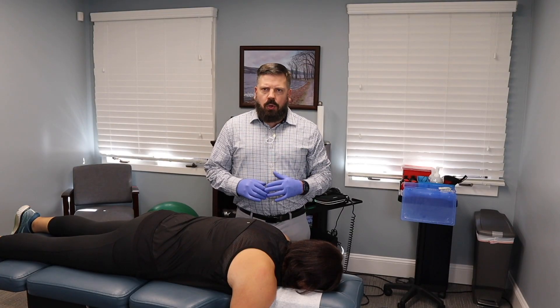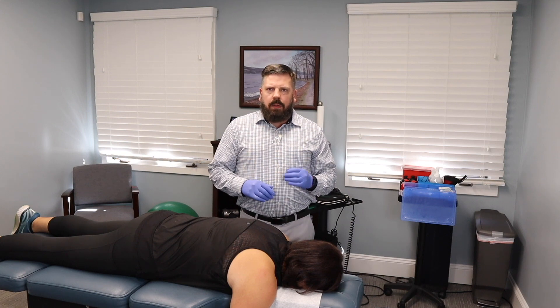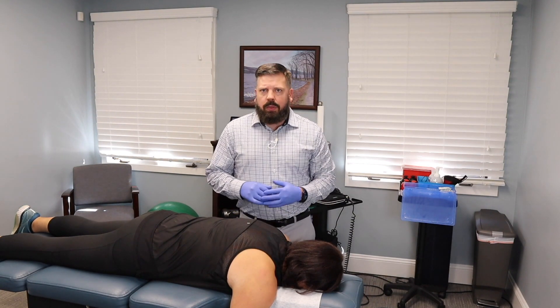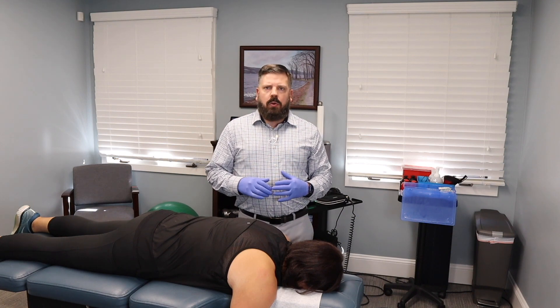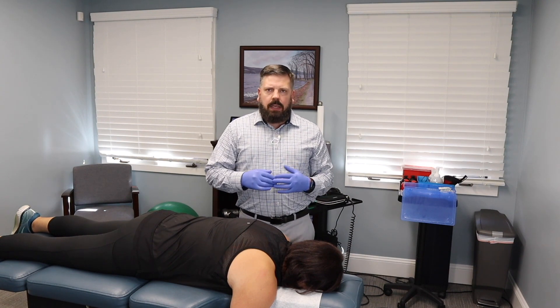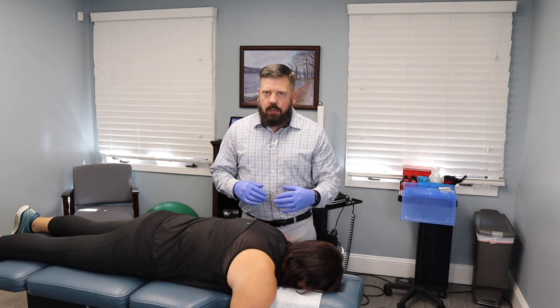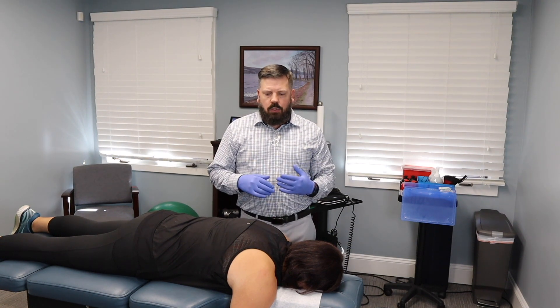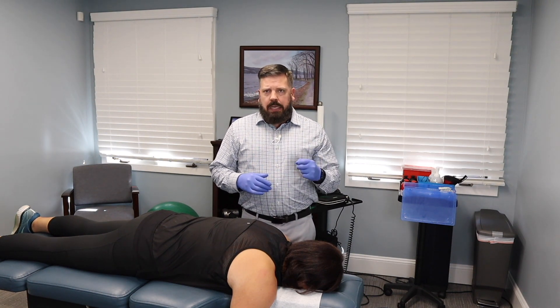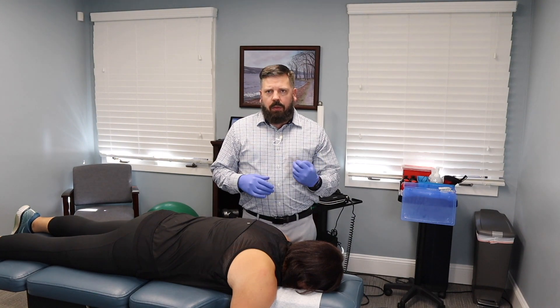Another effective treatment for frozen shoulder is dry needling. We apply an acupuncture needle into a trigger point or tight area to release that tissue and improve range of motion. One advantage of dry needling over active release technique is that we don't have to put the shoulder through a range of motion. Whether the patient has full or very limited range of motion, we can perform the same treatment. It can also get very deep — right down to the bone level — reaching deeper structures we can't access by hand.